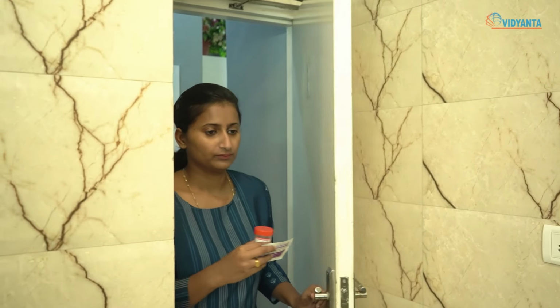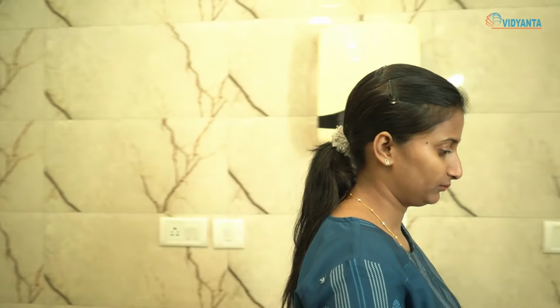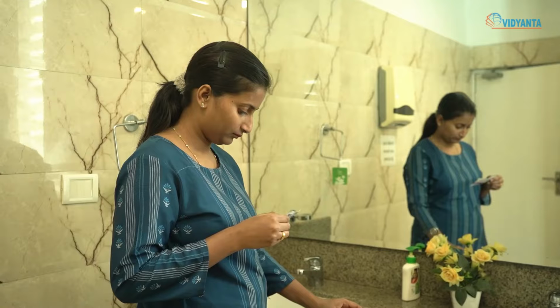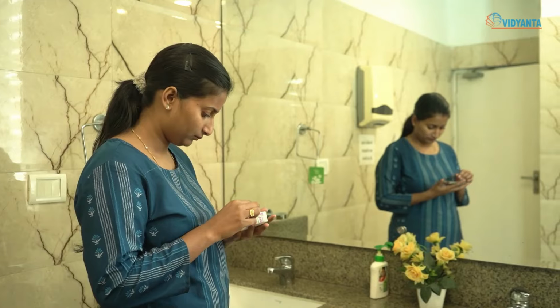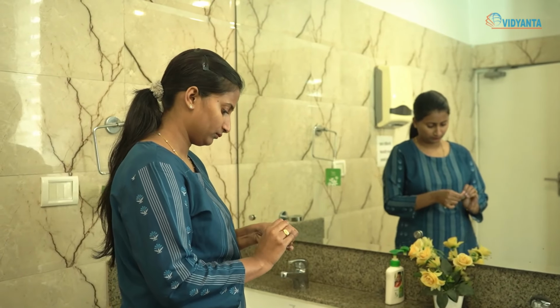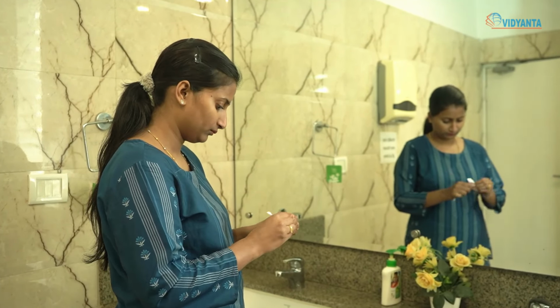In general, to get the most accurate results with any home pregnancy test, you will need to check the expiry date, test your first morning urine. Morning urine usually has more HCG than the urine later in the day.